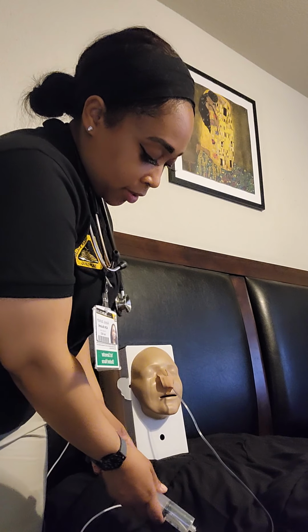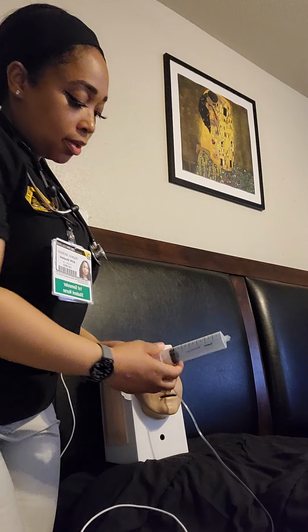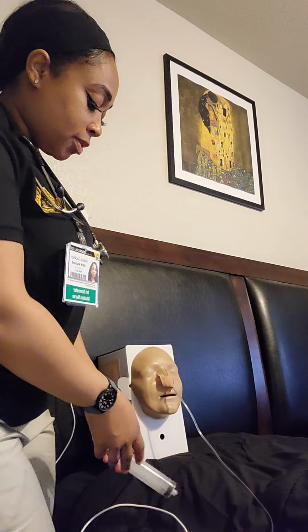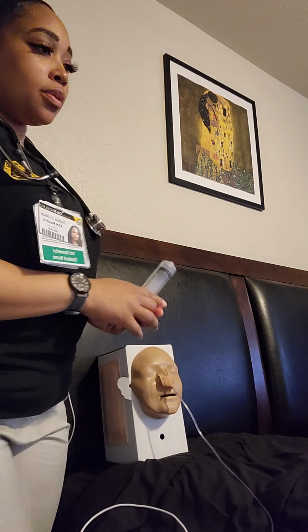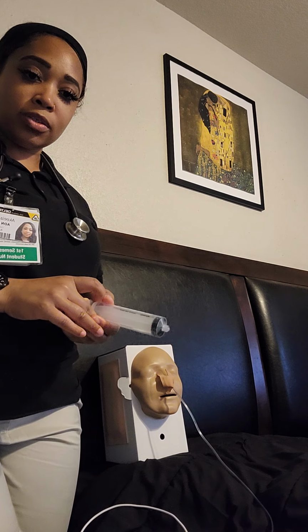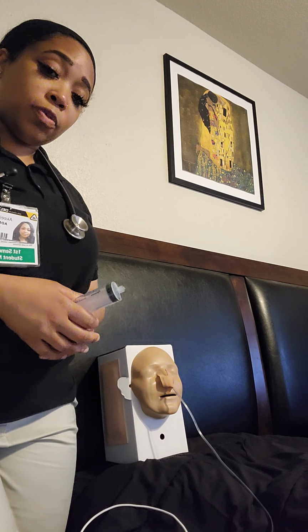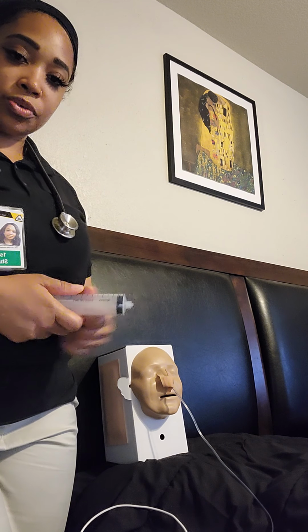So for my patient, I'm going to pull back all the way to 60 mLs and go ahead and expel the content into the graduated cylinder. And I'm doing this 4 times plus another 10 mLs. So that's 250 mLs total. And according to SJVC Hospital, we can go ahead and perform a gravity tube feeding as long as the residual is less than 300 mLs.